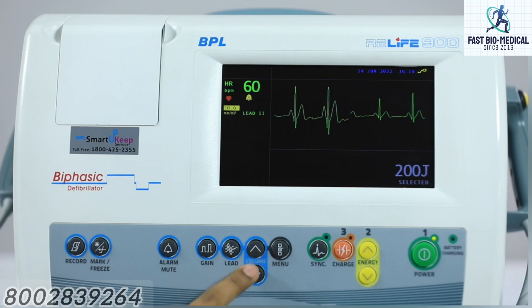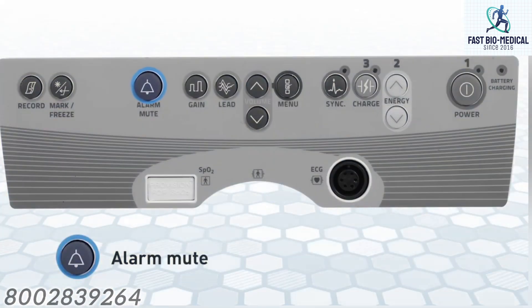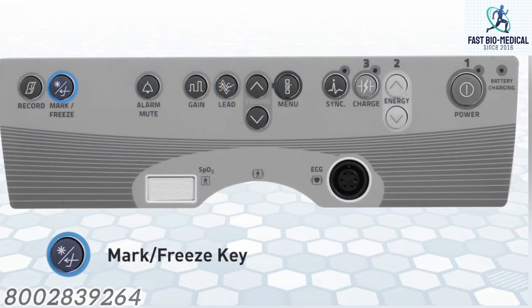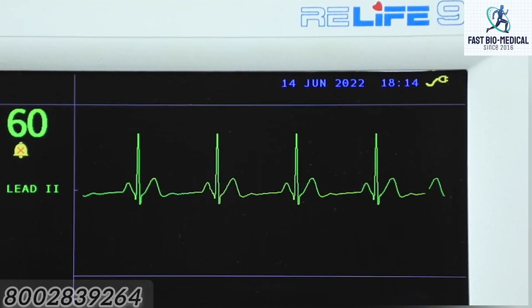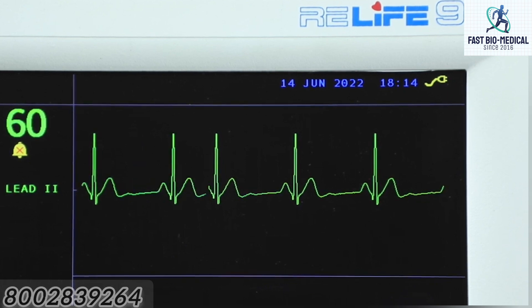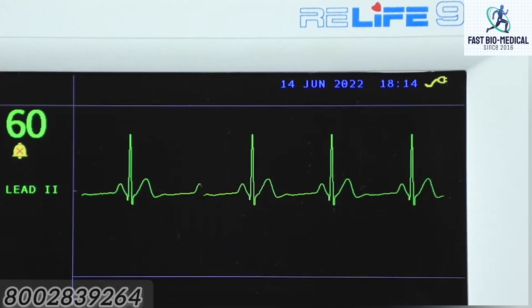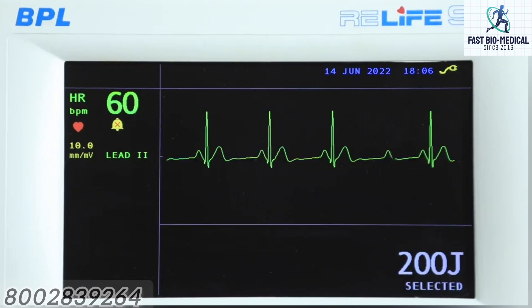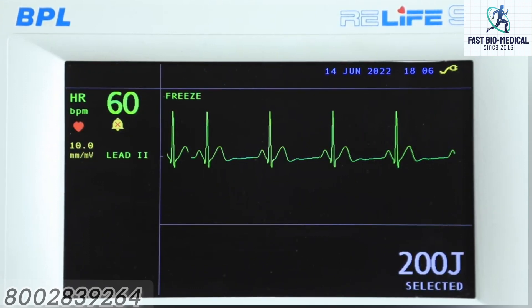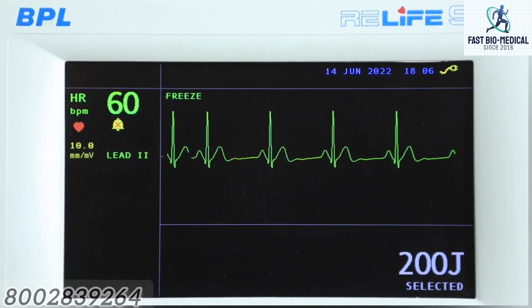Alarm mute: mutes the alarm sound. Mark/freeze option: this key can be configured as a mark key or a freeze key in the main screen menu. If configured as a mark key, it functions as an event marker to mark and store the ECG data. When configured as a freeze key, pressing it will freeze all the displayed traces on the screen, indicated by the message 'freeze' on the display.